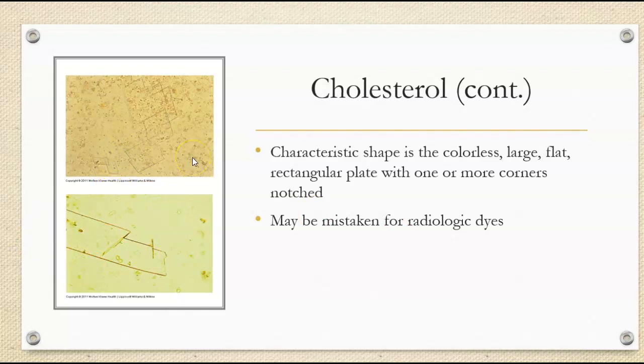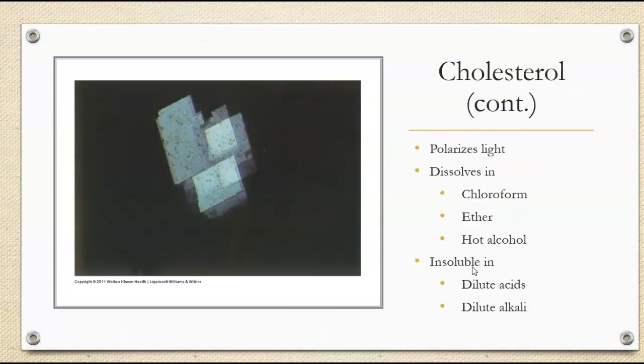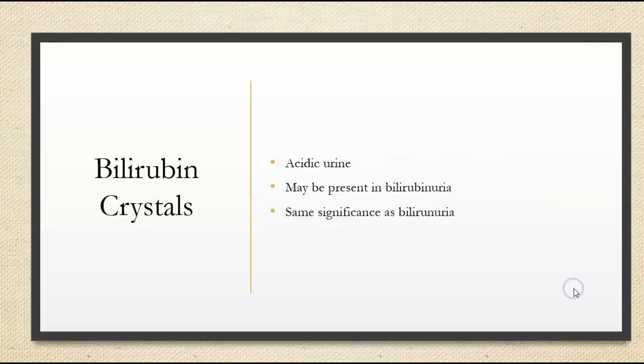We can sometimes mistake them for radiologic dyes, because radiologic dyes will have these little thin needles present as well. It will polarize the light. It'll dissolve in chloroform, ether, and hot alcohol, and it's not soluble in dilute acids or dilute alkali.